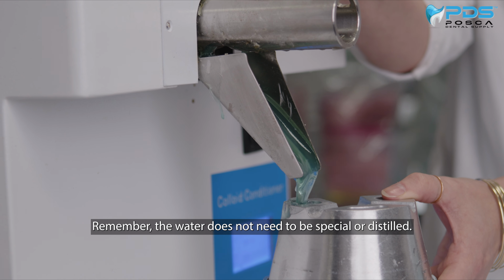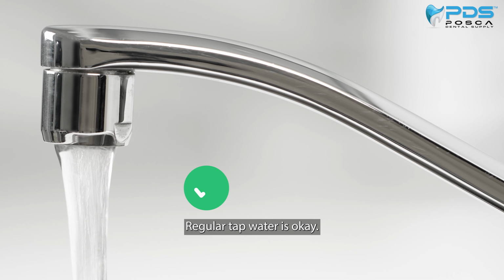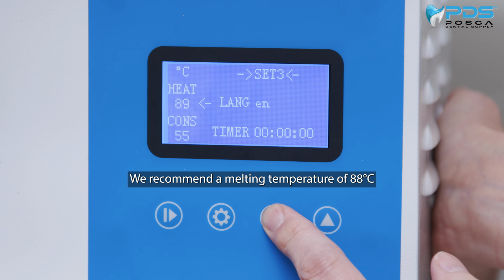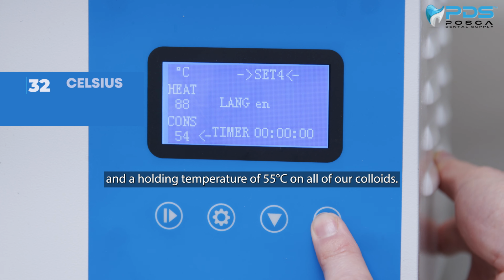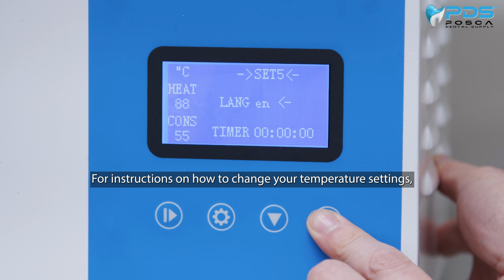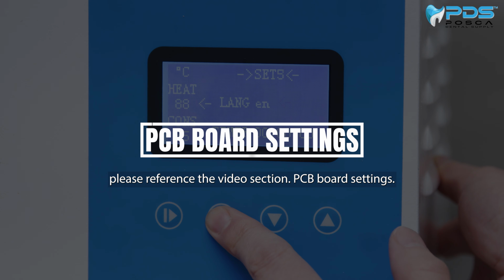Remember, the water does not need to be special or distilled. Regular tap water is okay. You may also want to adjust your temperature settings. We recommend a melting temperature of 88 degrees Celsius and a holding temperature of 55 degrees Celsius on all of our colloids. For instructions on how to change your temperature settings, please reference the video section, PCB board settings.